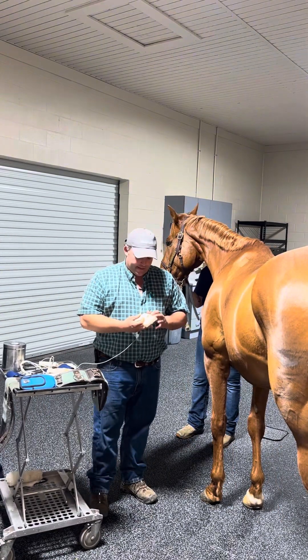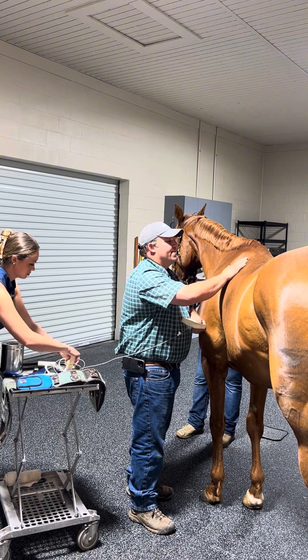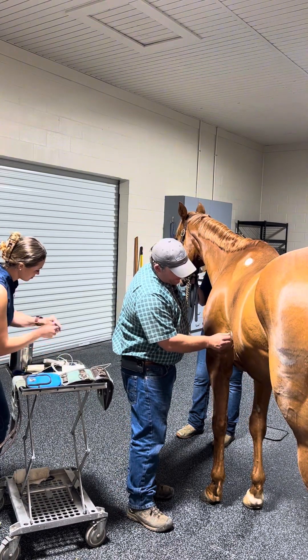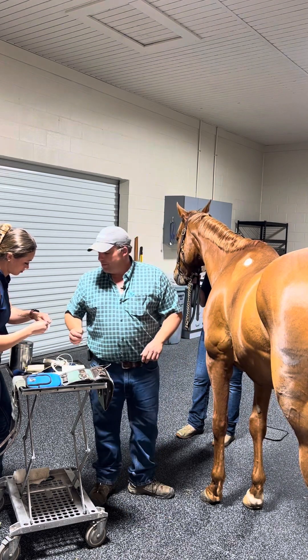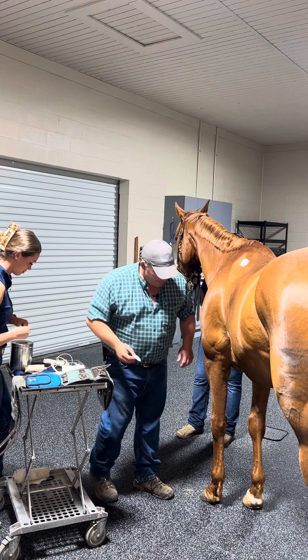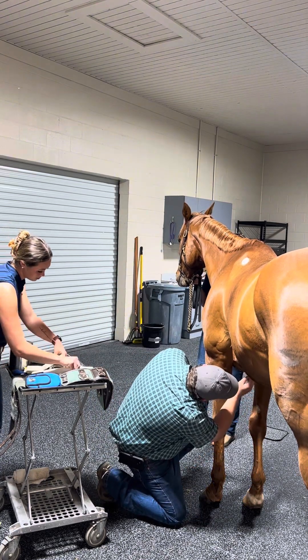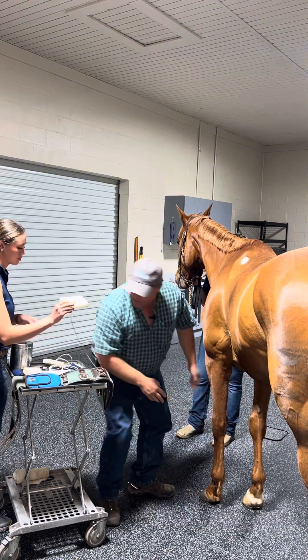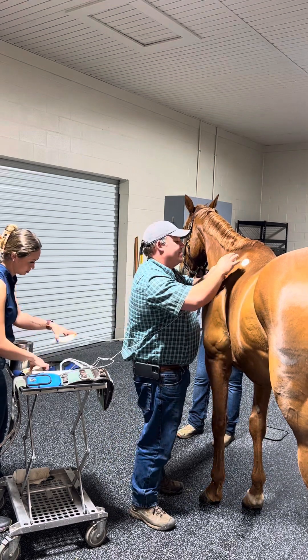So we're going to peel our ECG electrodes. These stick right onto the skin. We'll put another lead here, and we're going to put one more down under the belly. Now once those are attached, we'll connect our leads. These go in a very specific order.